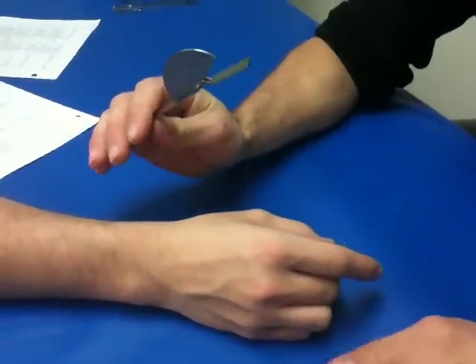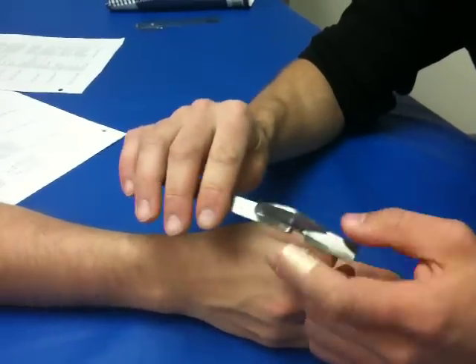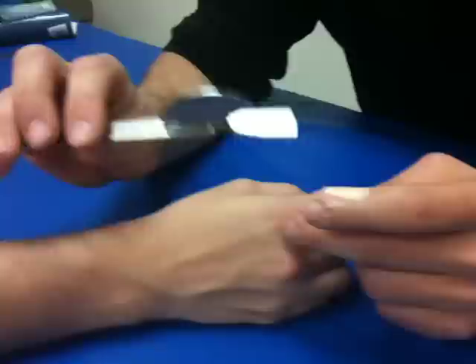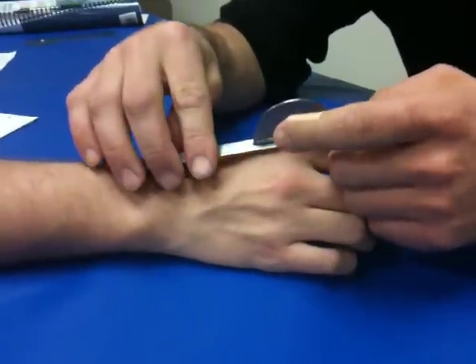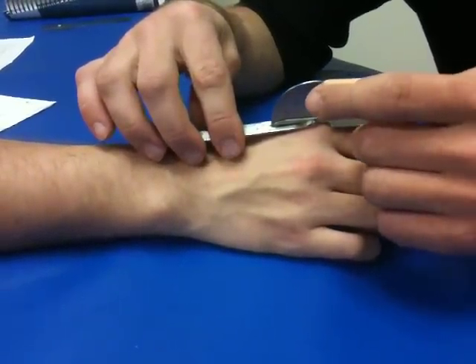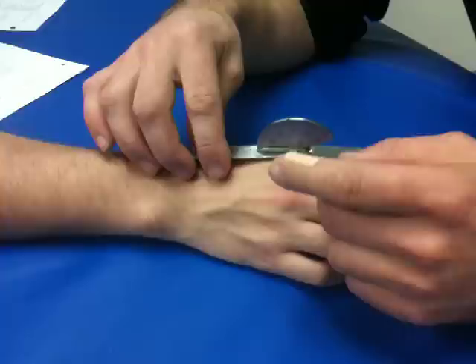This is digit 2's MCP flexion. You're going to put the fulcrum over the MCP joint, stationary arm over the second metacarpal, and the moveable arm over the midline of the second phalange.